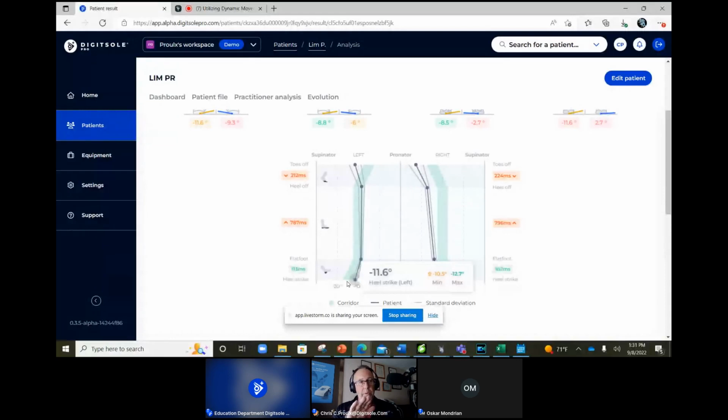And the position of the sensor as it's placed in the shoe, we're really looking at this as a block model, so really looking at the midfoot to the rear foot. So how the foot actually responds inside of the shoe, which is different from barefoot manipulation of the foot as it comes in contact with the ground. We know that the forefoot goes into a slightly different position than what we see in the heel. So just keep that in mind.